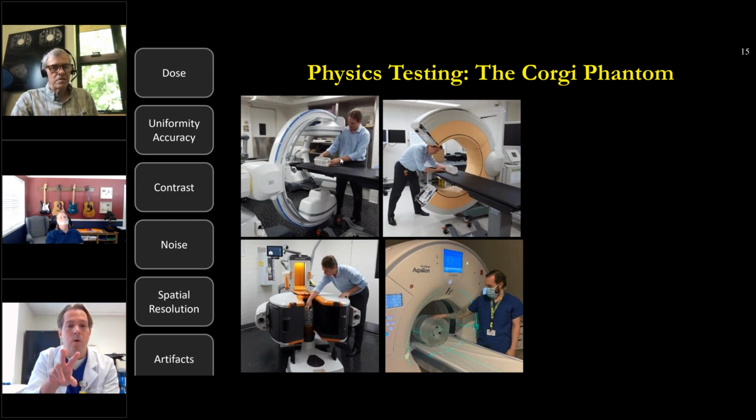Yeah, so as you know, Elliot, you're on the edge of a complicated space of effective dose. And so there are some factors of radiation biology, which we don't need to talk about today, that would differentiate one's description of the effective dose of a sinus scan versus, let's say, an ankle scan.